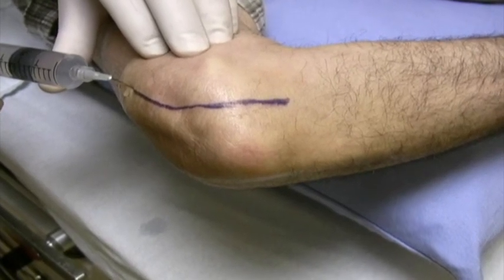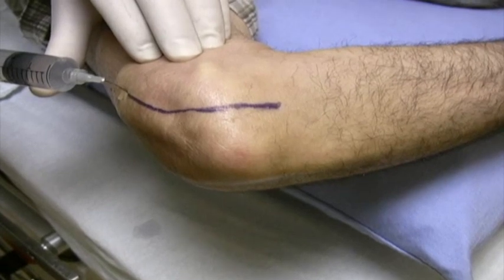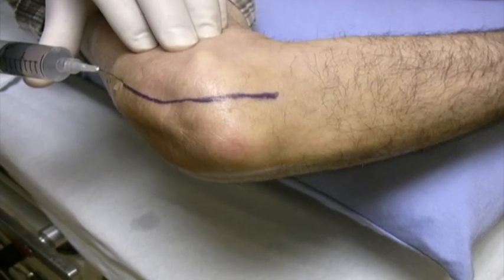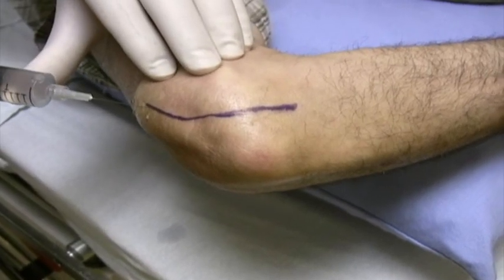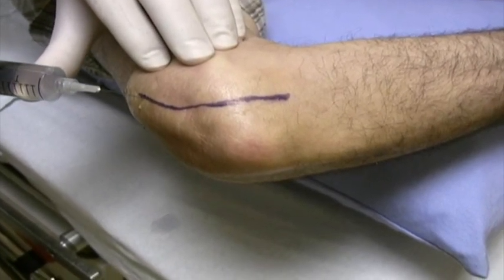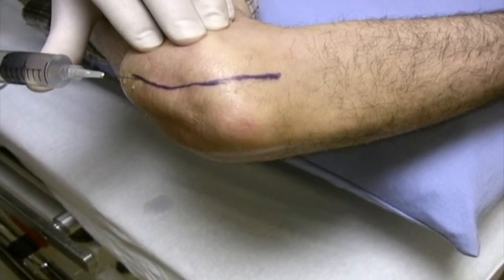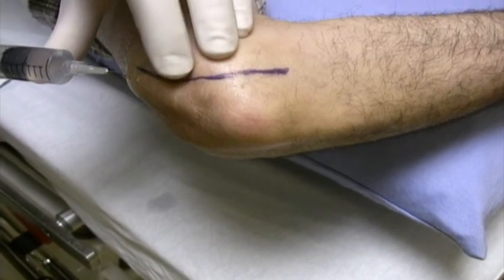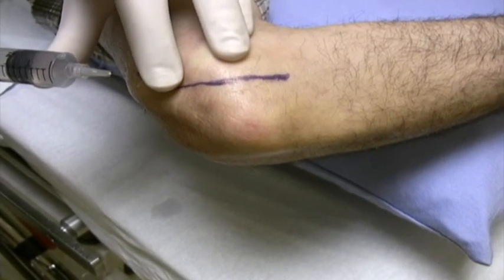I like to get at least 40 cc's up in the elbow, and so far I've put in about 10. And then another key, of course, is to give it time to work. And so we inject these patients well ahead of the surgery, and you can inject them on a stretcher outside of the main operating room if that's what you choose to do.